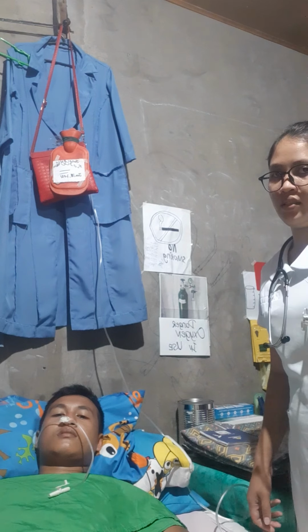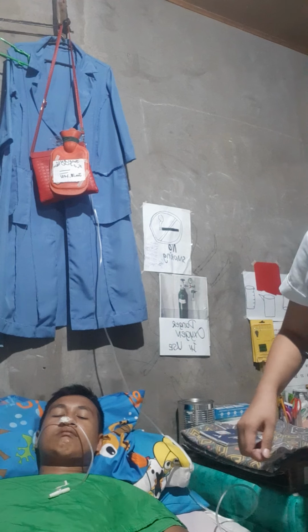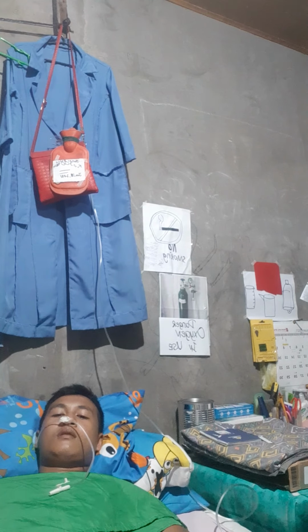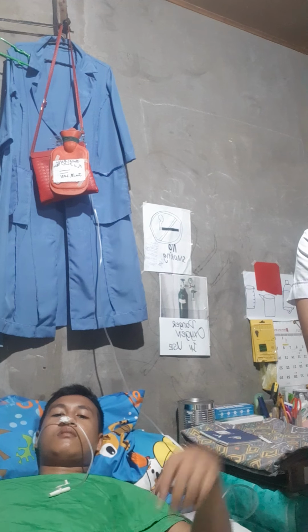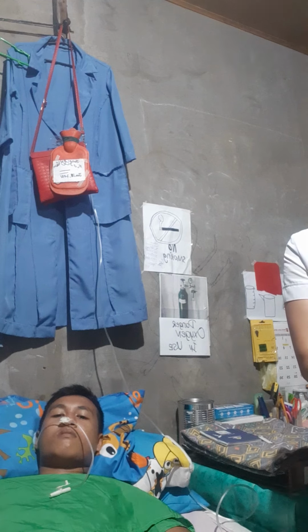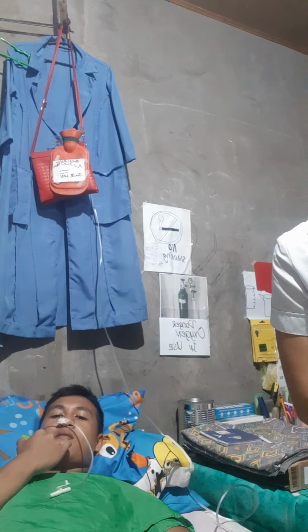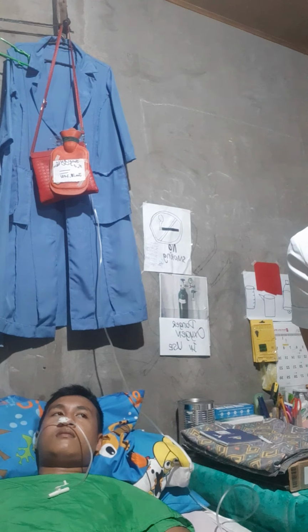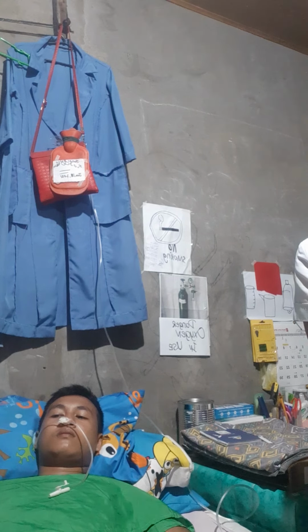remove the gastric tube. But before that, we're going to put on gloves to protect us from the secretions. Instilling 50 ml of air into the tube is optional because this clears the tube of any contents such as feeding or gastric drainage.